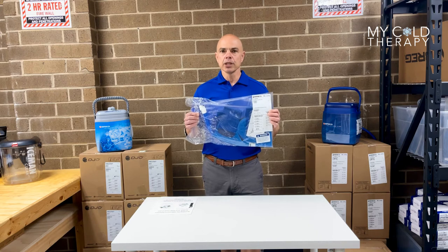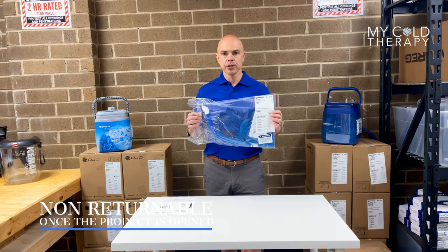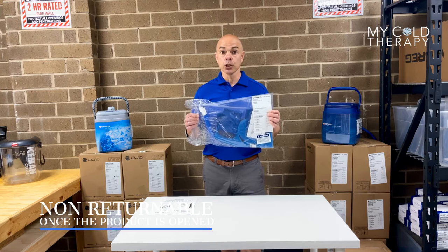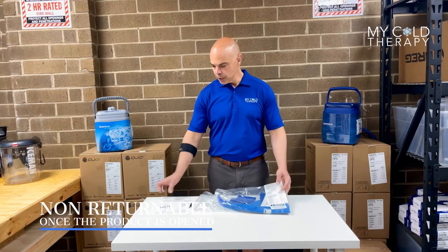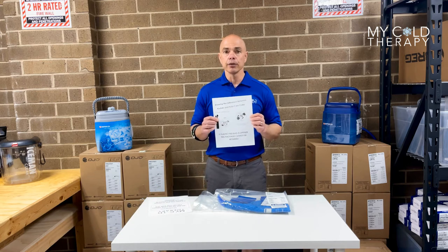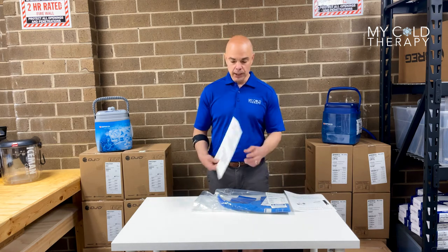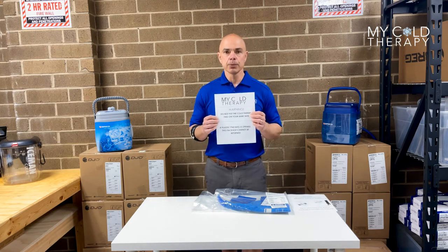Since these pads are sealed, once they are open you cannot return them. Most of our patients are surgery patients, so for the risk of infection everything must go out sealed. Every single bag is going to receive a connector letter so that way you know you have a Kodiak or a Cube — please take note of which connector you have. You're also going to get a skin warning label that says please do not put this on your bare skin for risk of harm.